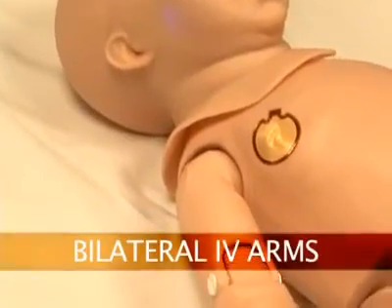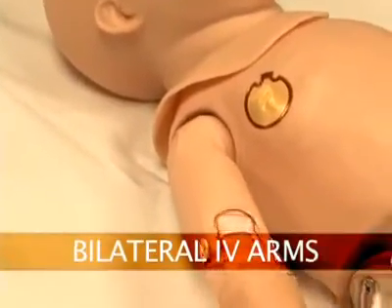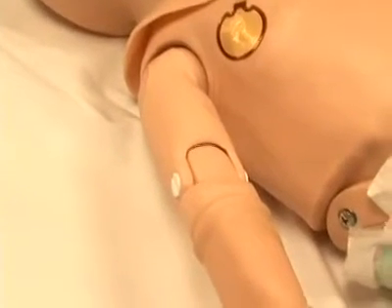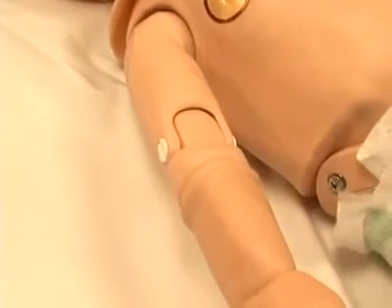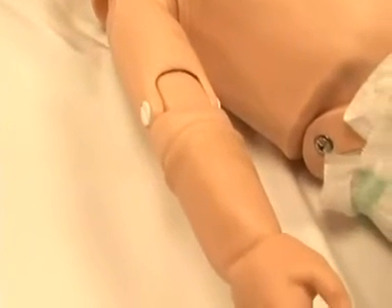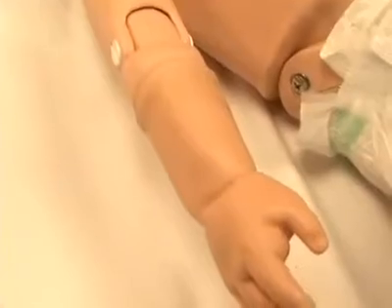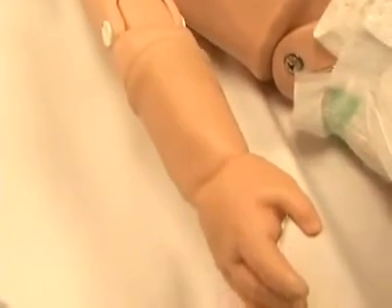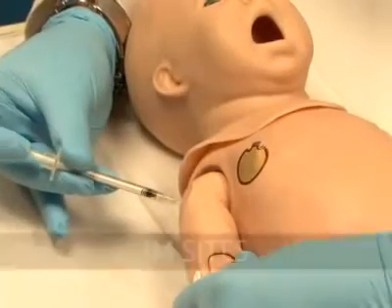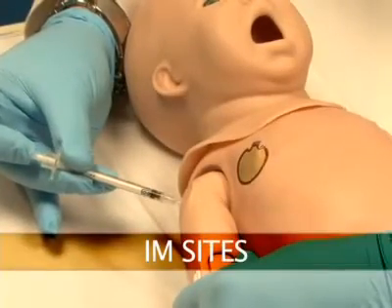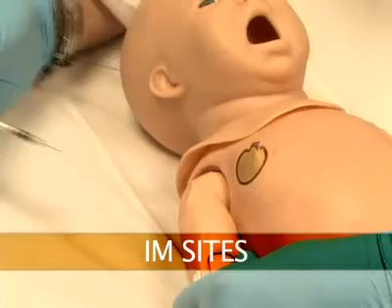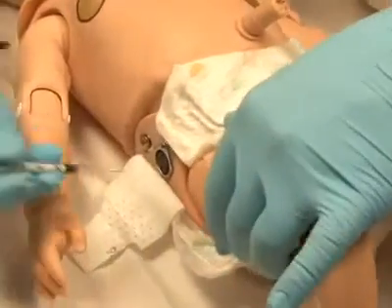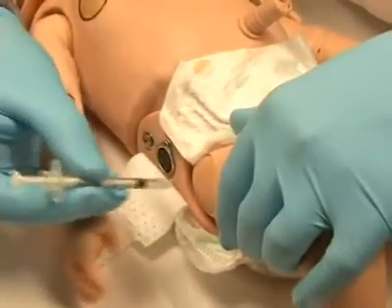Newborn HAL has bilateral IV training arms that could be used for bolus or intravenous infusions, as well as for drawing fluids. In addition, he has IM sites on both his deltoids and quadriceps.